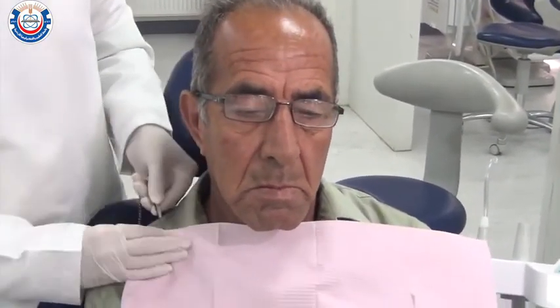Seat the patient in the dental chair at a height that's comfortable for you. The patient should be at the level of your elbow.